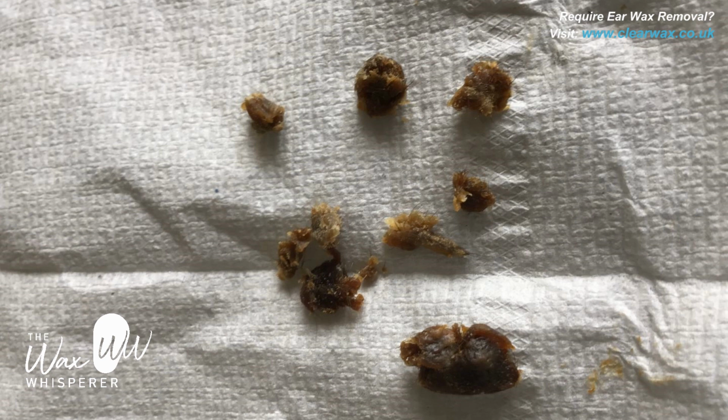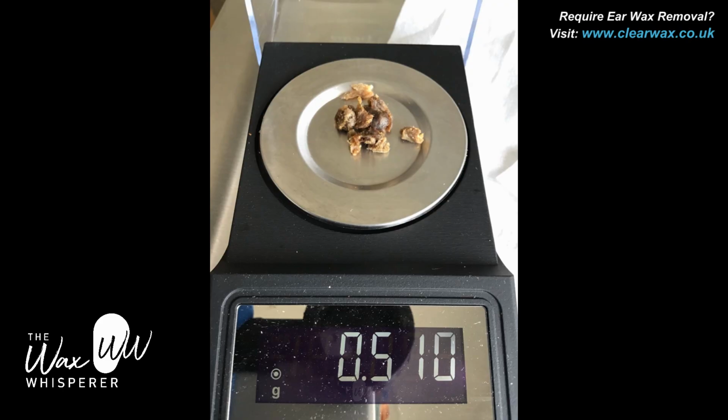That's all the remnants of both ears. You can see it's like a clay soft type consistency, a bit like wet mud. I actually weighed this wax and it just came in over 0.5 gram, so 510 milligrams.